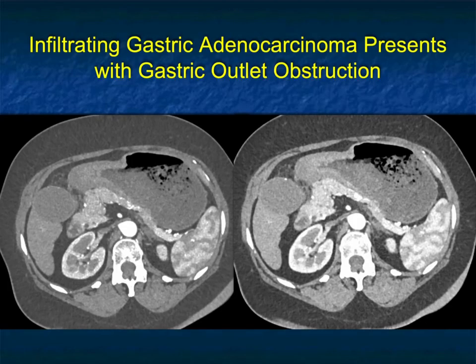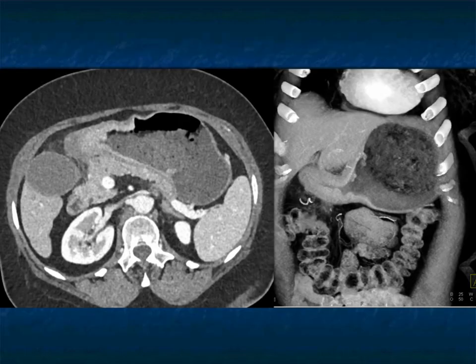Here's a patient presenting with gastric outlet obstruction. You can see fluid in the stomach, a bunch of air bubbles from retained food matter, and the infiltration in the antrum very nicely seen. There's some stranding around the antrum. You can see it particularly well in the coronal view, which really opens up the stomach.